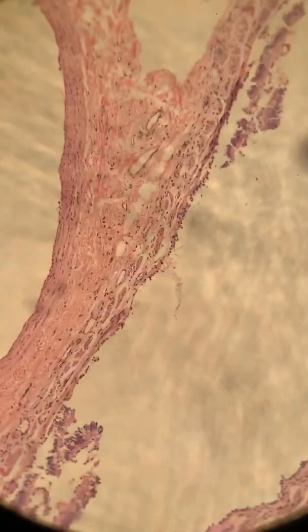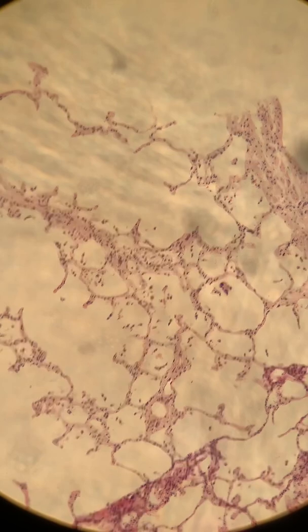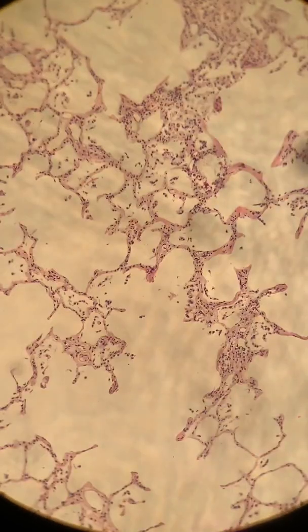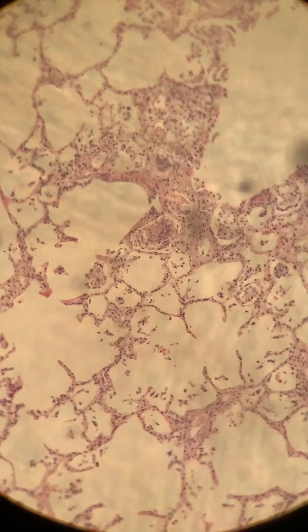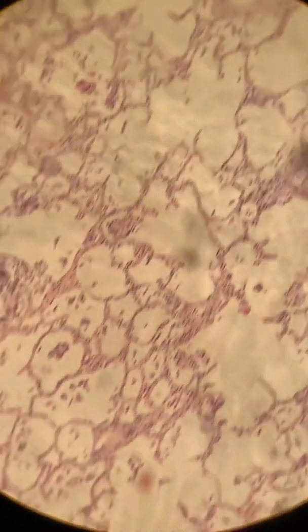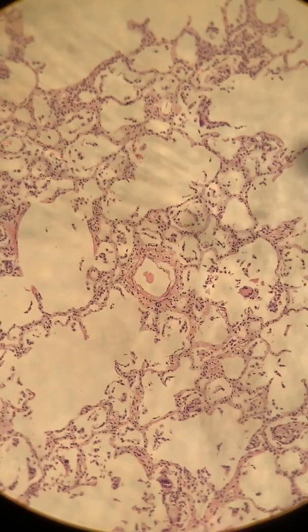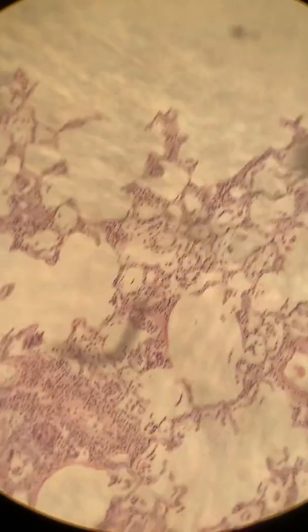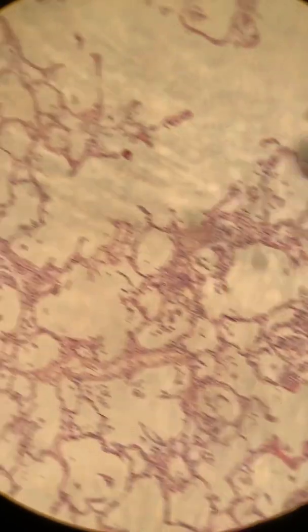Let me just go around faster. That way we'll see more inflammatory reaction within this lung sample. There's a little more information there, and we'll go down even closer. But you can see there's a few giant cells here. If I can keep going around, there's one there in the center, a multinucleated giant cell. So this is definitely an inflammatory reaction to those yeast-like elements that I showed earlier.